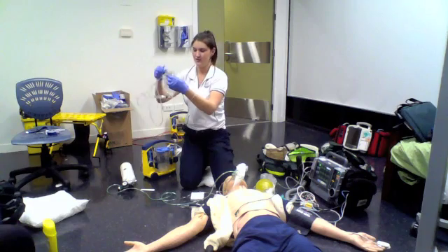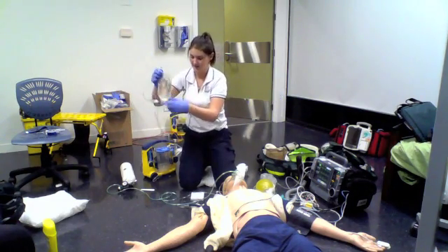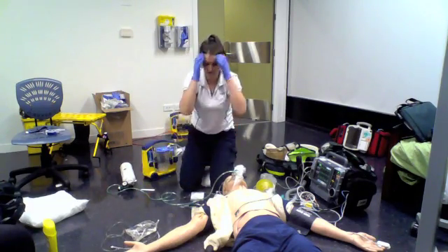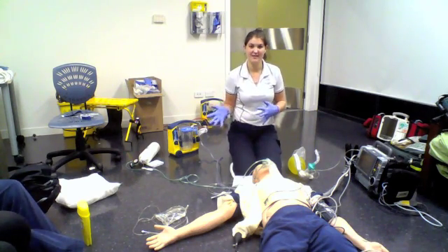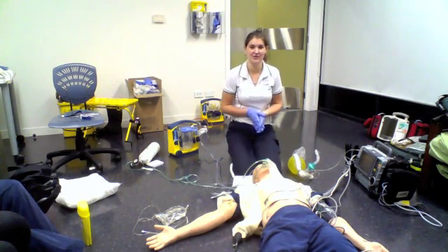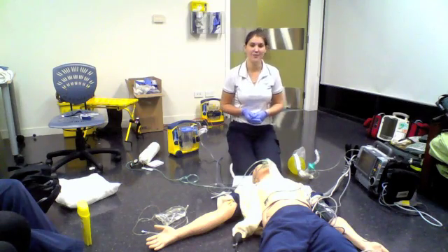This is just 500 mils, but I'd use a litre of saline, and that's all prepared, ready to go. It is important that we have oxygen and fluids ready to go, with oxygen attached at the moment, to prevent secondary brain injury. Secondary brain injury can be caused by hypoxia, hyper or hypoventilation, or hypovolemia.